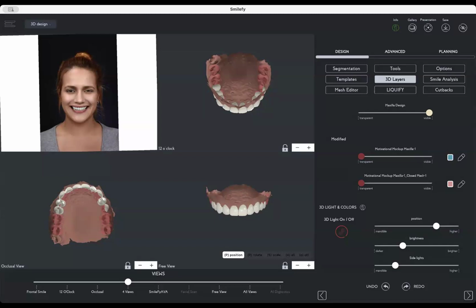About the learning curve, we do have the course, we do have the integration consultants, and they will go with you step by step in every single detail. And you will, of course, grow with every single case. And we offer full support, because we want you actually to have control about your cases, about your designs, and that's the way to go.